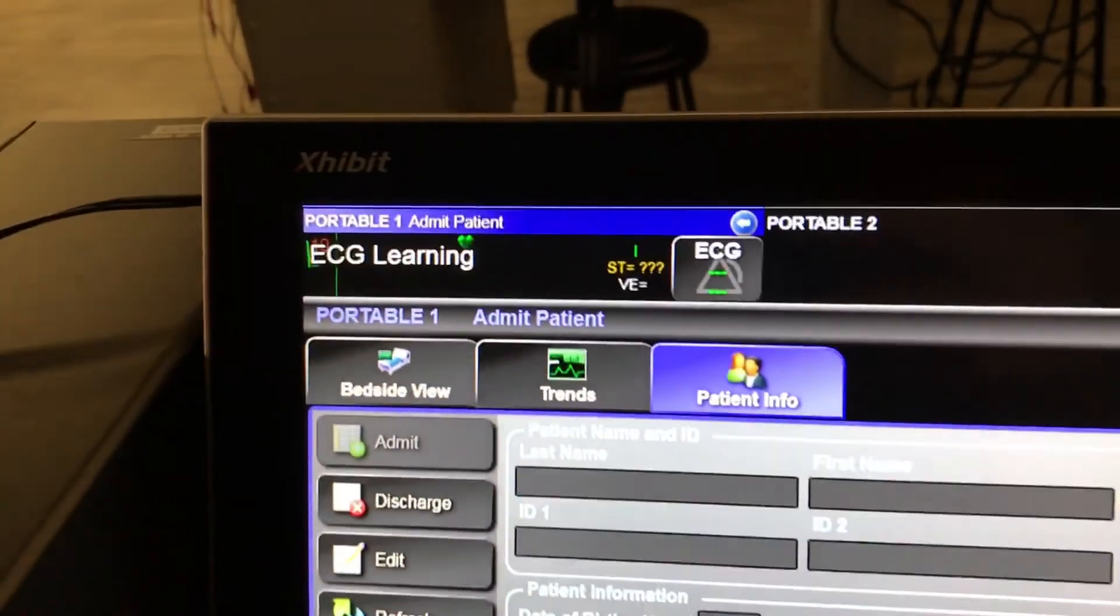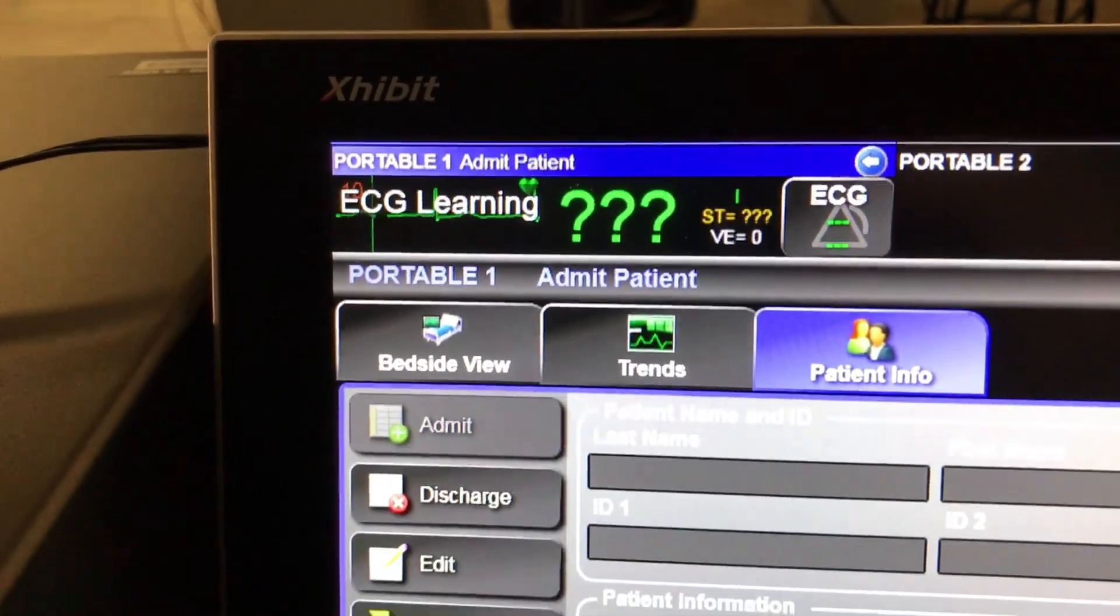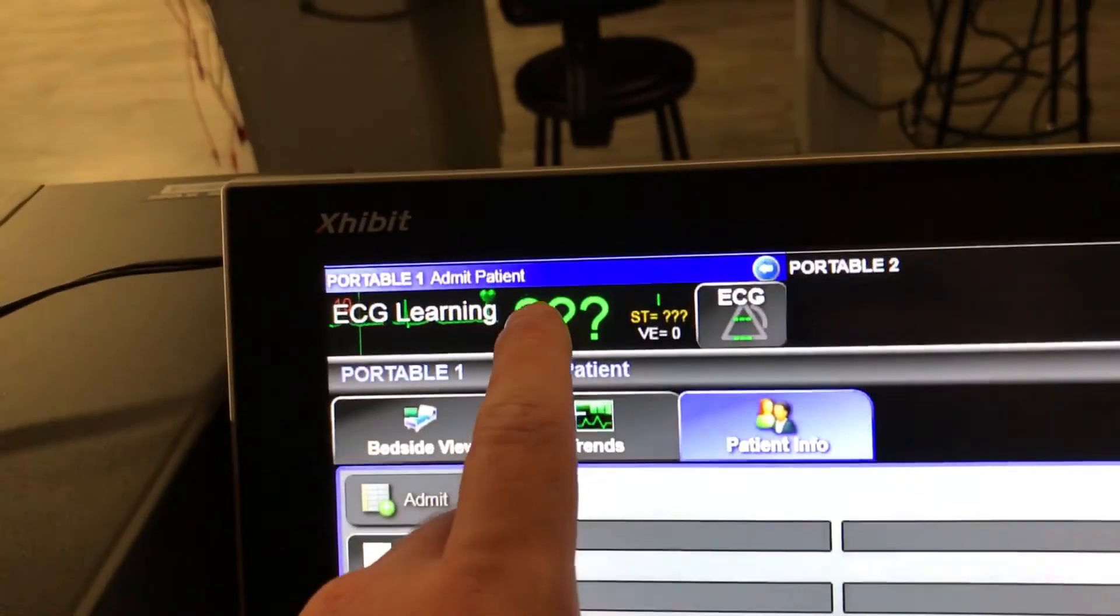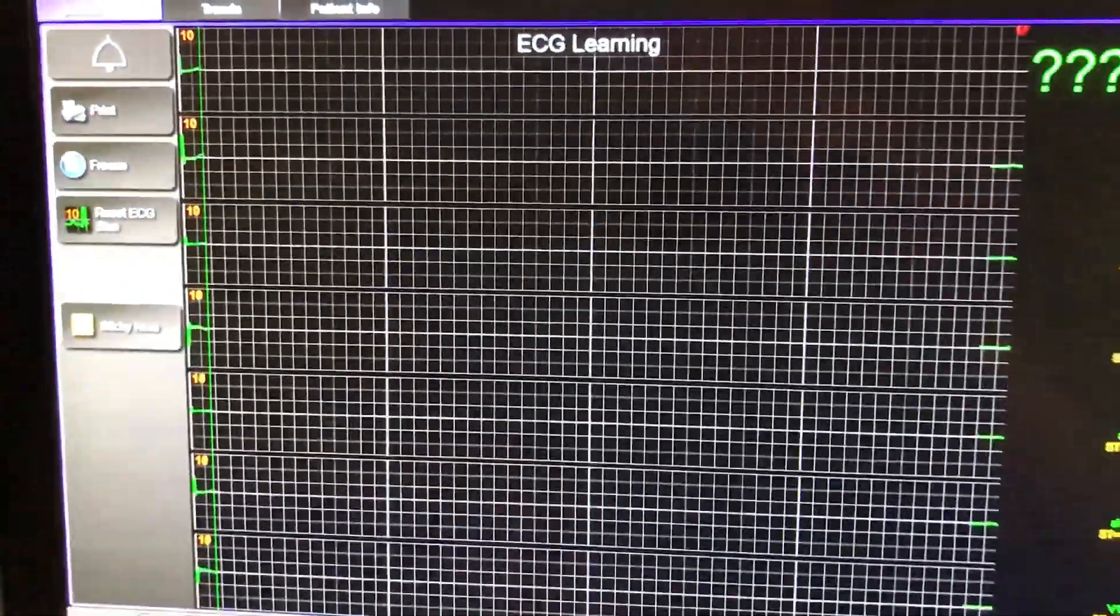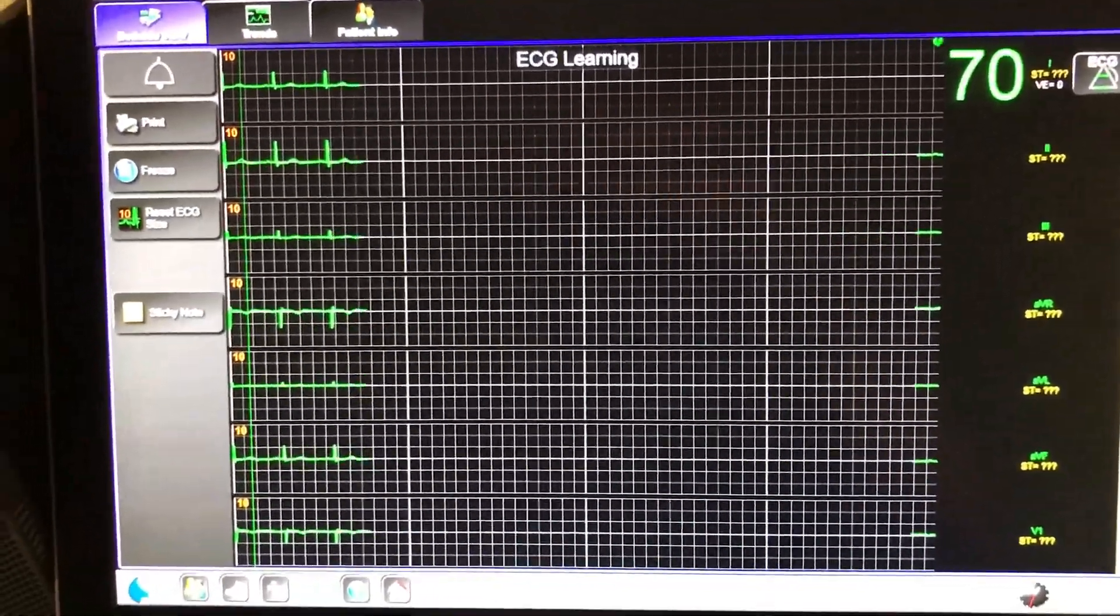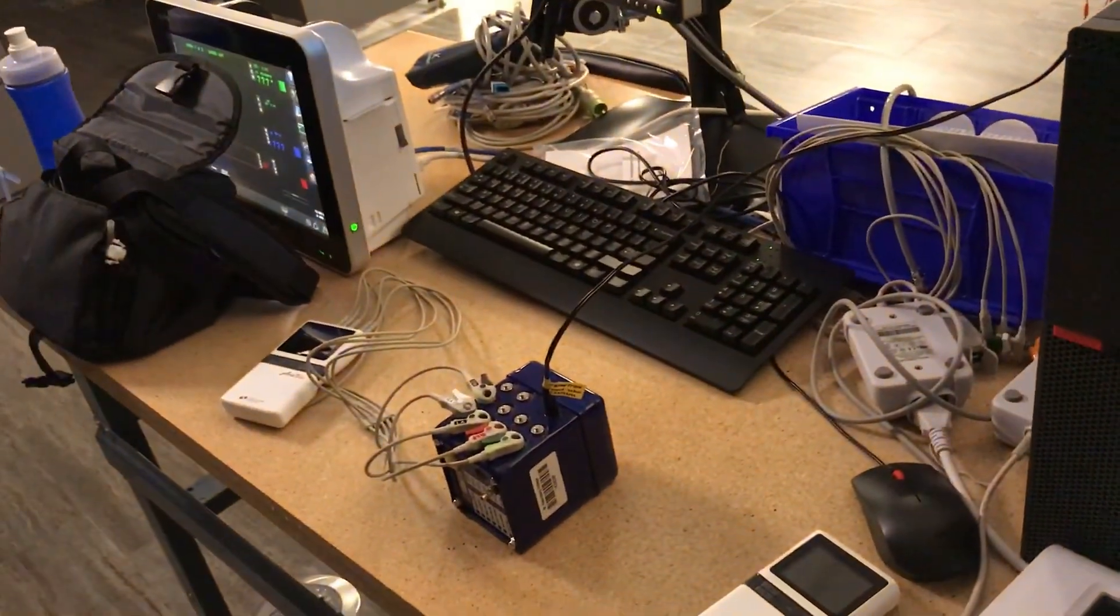And from here, it'll start pulling up trend information from that channel. So now you can click on there and it'll pull up the full screen. And it's pulling the trend information from that portable unit.